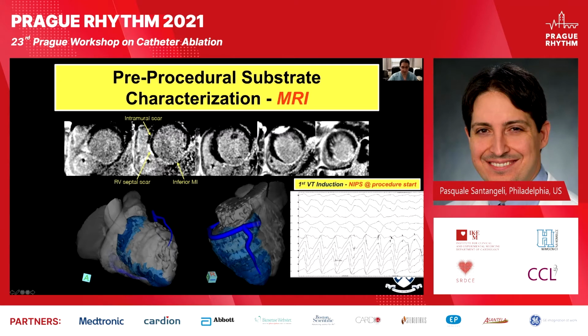Here you can see the VT that matched the intracardiac EGMs, was inducible with programmed stimulation and double extra stimuli. We matched the intracardiac EGMs and cycle length of the stored clinical episodes from the ICD. And as expected, it wasn't hemodynamically tolerated and had to be cardioverted promptly. It is a right bundle branch block superior axis VT, which is compatible with the location of the abnormal substrate.